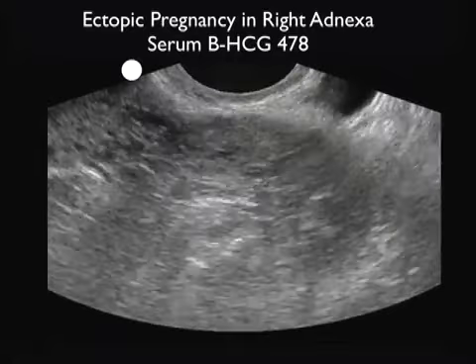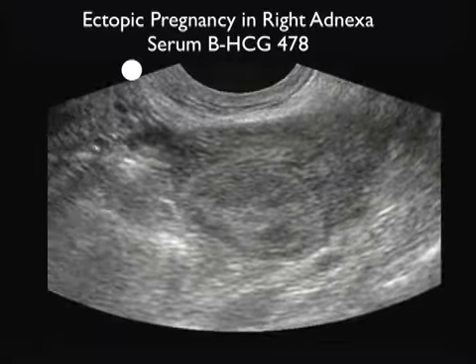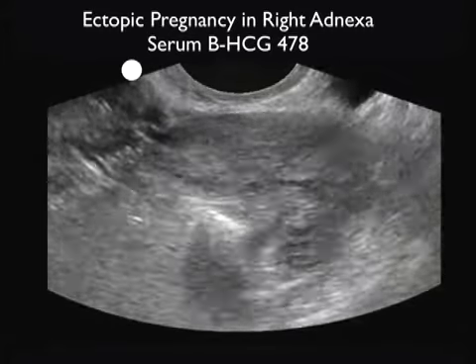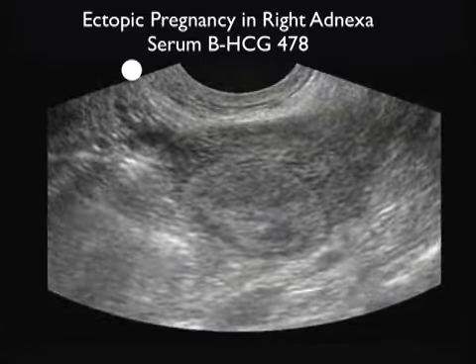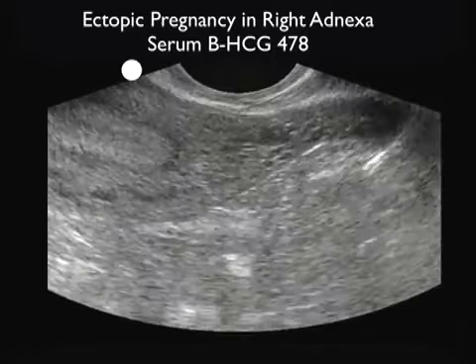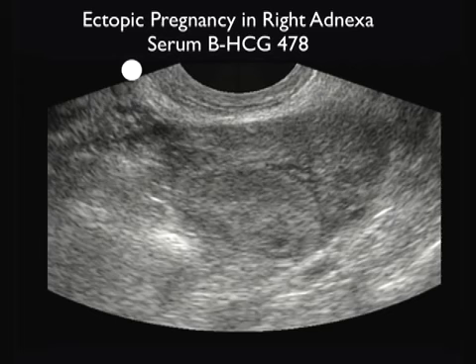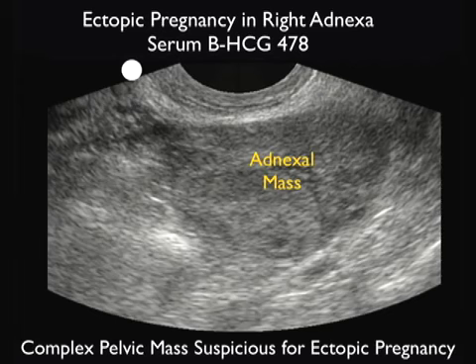Here's another ectopic pregnancy, and I'm scanning out from the midline uterus, as seen there, out towards the right adnexa. And notice there what we see is another complex pelvic mass out towards the right adnexa. Next we're going to still that image down, and it almost looks like an egg-like type appearance of a structure inferiorly within the adnexal mass. Very suspicious again for an ectopic pregnancy.